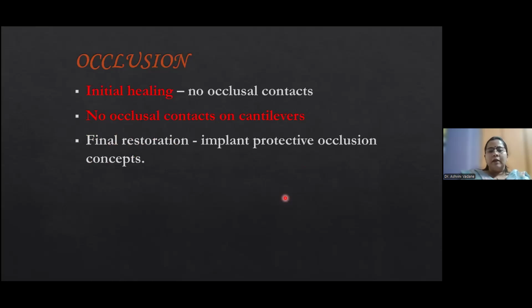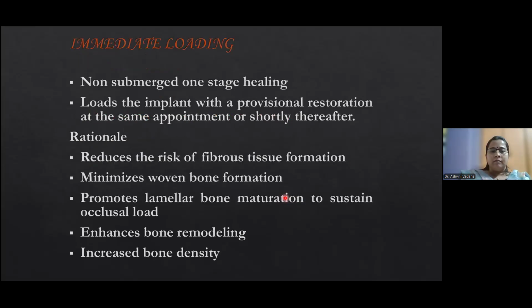In the initial healing phase, there should not be occlusal contacts, and there should be an implant protective occlusion concept. So there should not be any heavy occlusal contacts in that region. So this was about the two-stage loading.